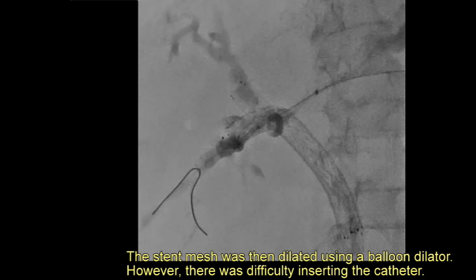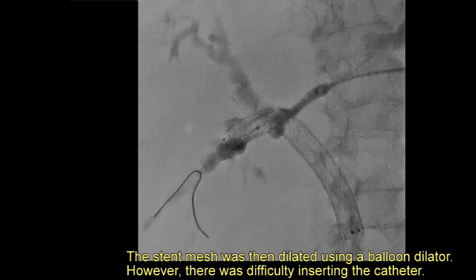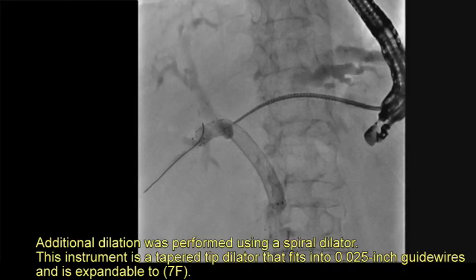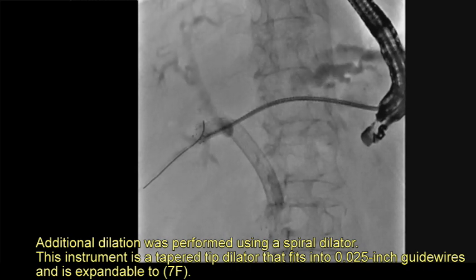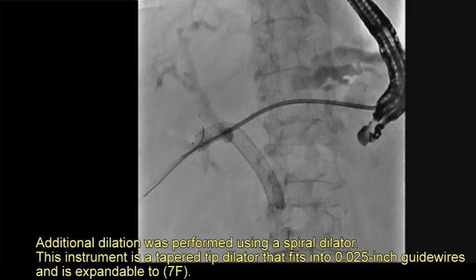The stent mesh was dilated using a balloon dilator; however, there was difficulty in inserting the catheter. Additional dilation was therefore performed using a spiral dilator — a tapered tip dilator that fits a 0.025-inch guide wire and is expandable to 7 French.